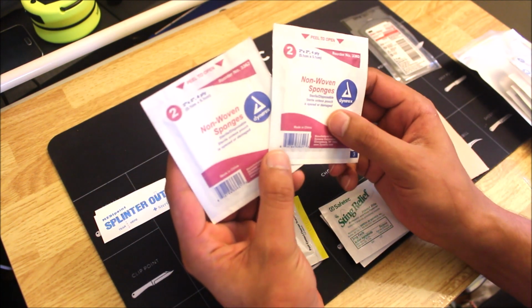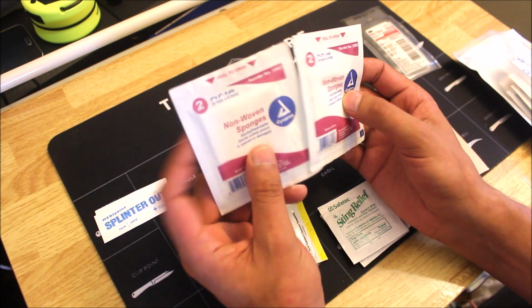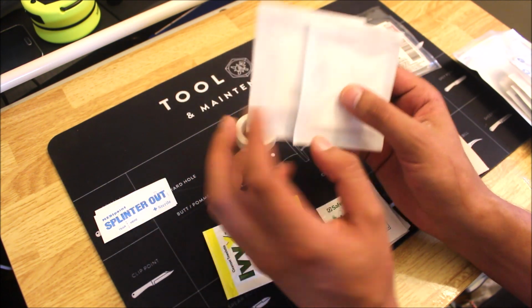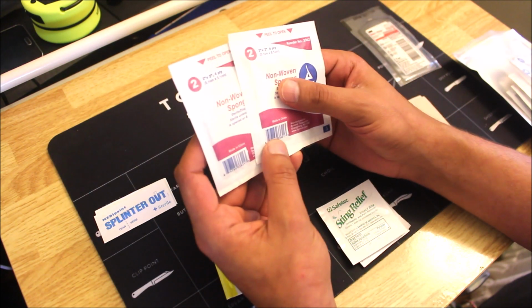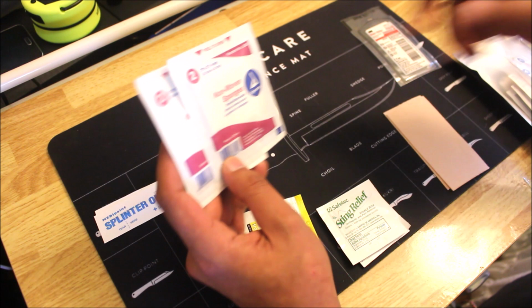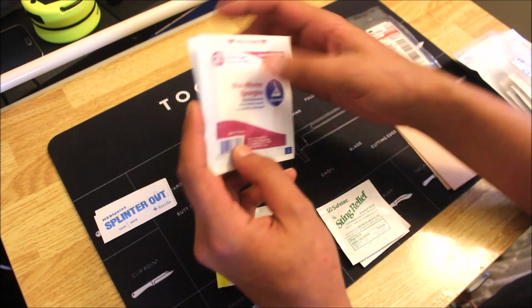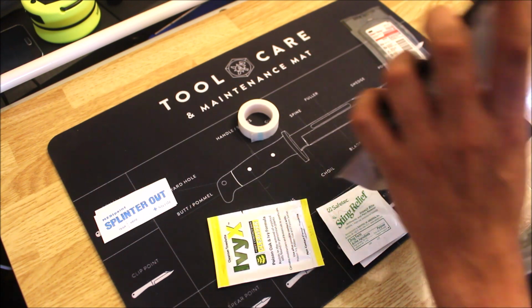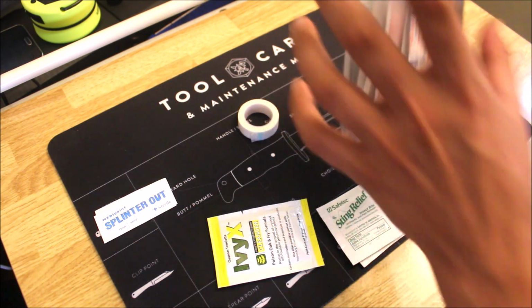Alright, here we have 2 non-woven sponges. Again, these are probably like gauze, I'd assume. They'll probably soak up a little bit more blood than maybe the other one would. So this is good to have. Again, you can wrap it up in tape or use a bigger bandage, something like that, to keep dirt and things out again. It's very important. You don't want all them foreign objects going in your body.